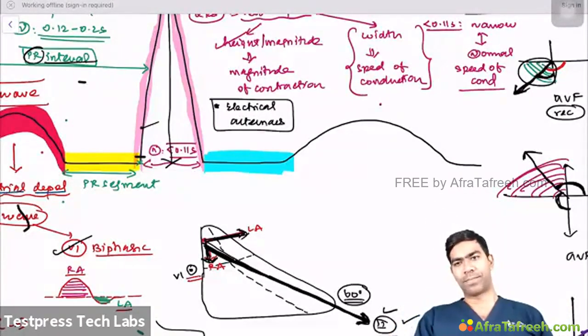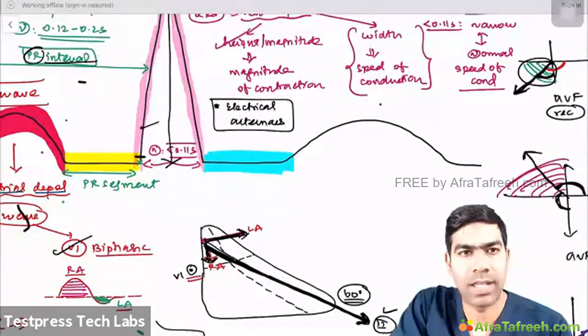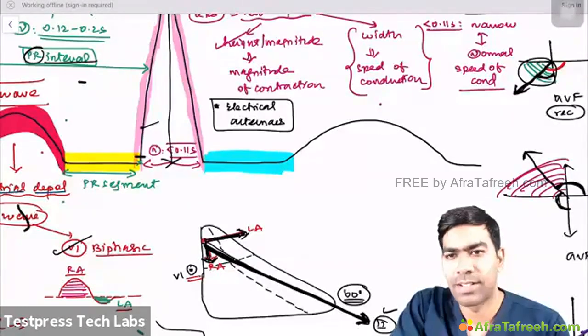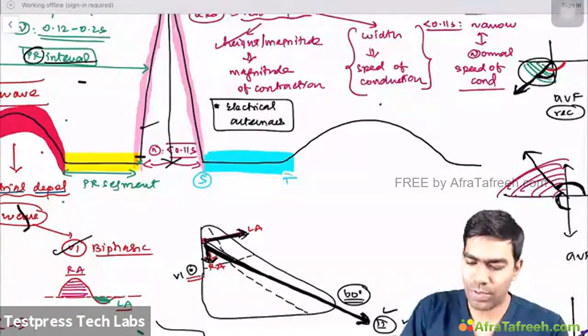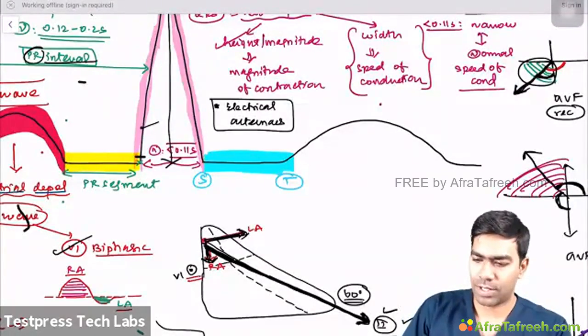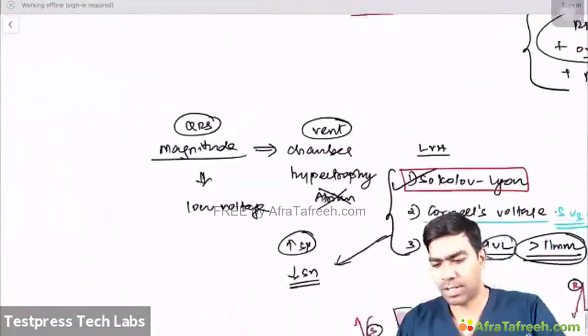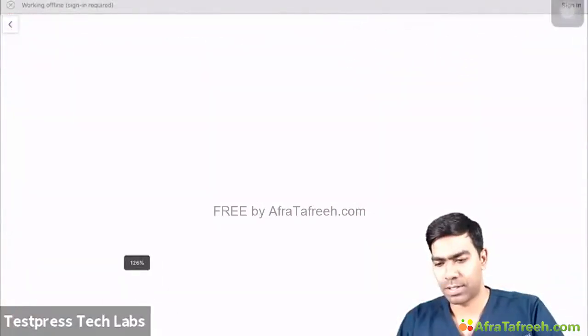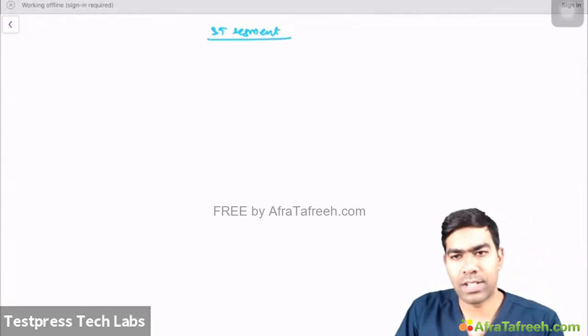What is that area that we are seeing here? The ST segment, correct. That's an ST segment. So this is what we are going to discuss next. I think I have to go down again. Okay, we are discussing the ST segment. So already we have discussed enough about that.